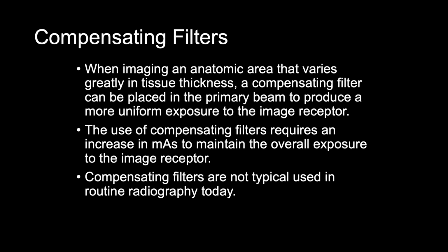Compensating filters are not typically used in routine radiography today, but always remember, if you're using a wedge filter, this would be for the toes primarily, because when we're doing a foot X-ray, the middle of the foot is a lot thicker than the toes. So the kVp and the mAs that we have going through the foot tends to burn out the toes because the toes are so thin.